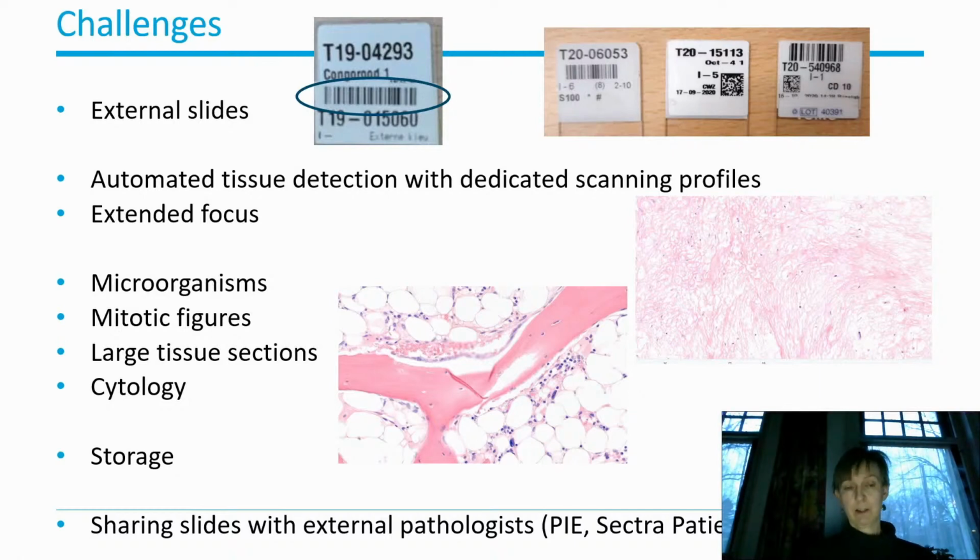Also, using extended focus will help to overcome problems of focus in, for example, these still somewhat irregular slides with bone in it, or other cutting artifacts. There are still some issues with the detection of microorganisms and mitotic figures, and of course also cytology is not really feasible now for routine diagnostics, not yet.